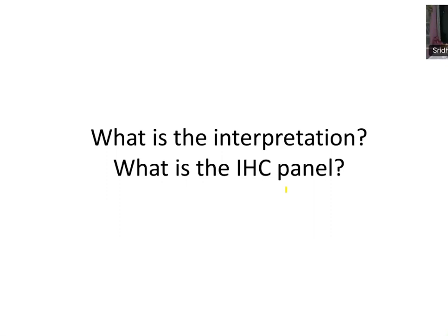So we can go for Olig2. Do you want to interpret the synaptophysin? It is very weak positivity, does not tell you anything. Any brain tumor can have this kind of synaptophysin-positive background. Just because you get synaptophysin positive, you should not say that it is not glial. Synaptophysin is a very poor marker in primary brain tumors. Don't interpret too much. Only because it's a 2-year-old baby, if you want to think of an embryonal tumor, synaptophysin is weak positive, but it does not tell you anything further.